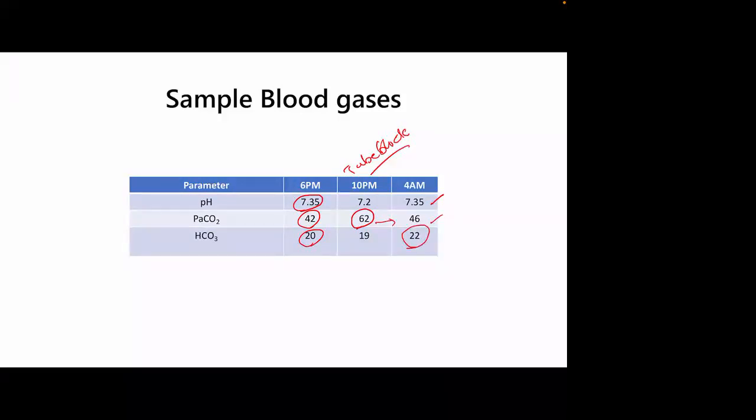So here there is respiratory acidosis, which has played a major role in the acid-base imbalance. We have to correct the carbon dioxide levels or the respiratory acidosis through ventilator adjustments and suctioning, and then we will reach normal or near normal blood gas levels for the infant. So it's not a single blood gas that can tell you about the patient as a whole, but you will have to see the serial blood gases.